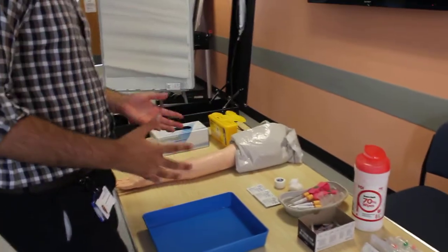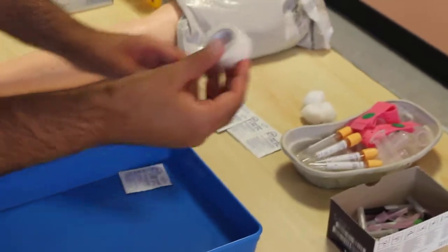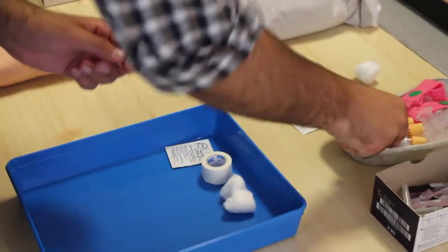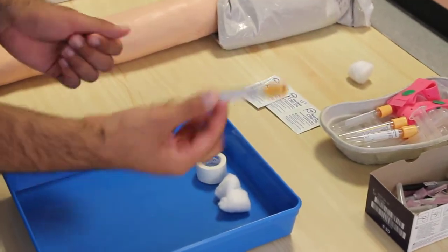After that, prepare your clean tray. Take an alcohol swab, tape, a bit of cotton, and the blood sampling bottle.